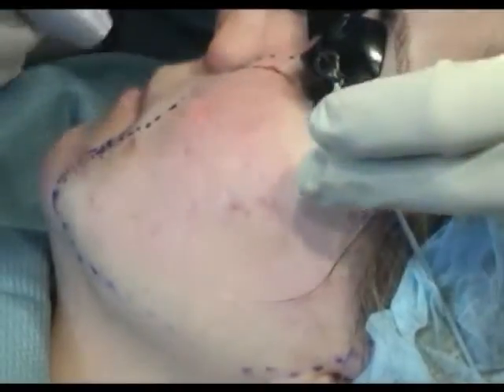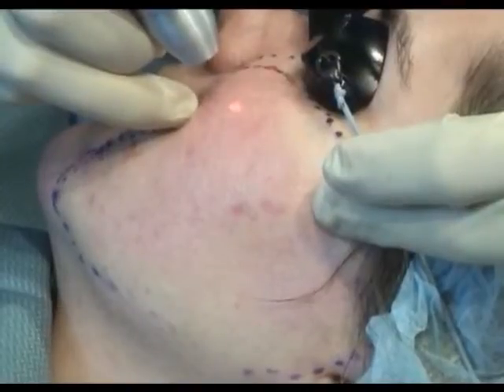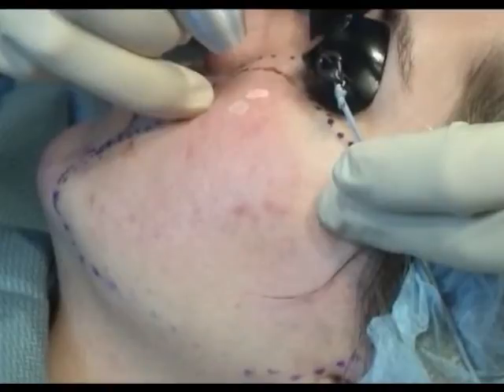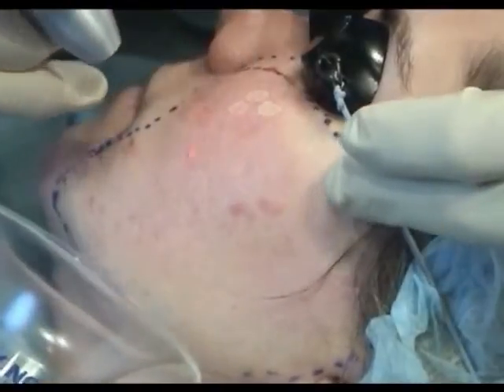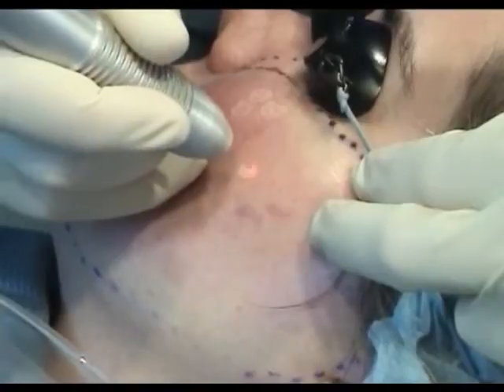When treating acne scars, I find it helpful to treat the shoulder or edge of the acne scar first, and then go on and treat the entire area. Here I'm using a 3mm spot size at 14 joules per centimeter squared with the erbium YAG laser. The same technique may also be used to flatten the edge of a wrinkle before treating the entire cosmetic unit.